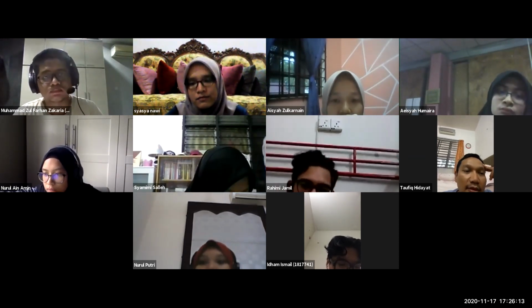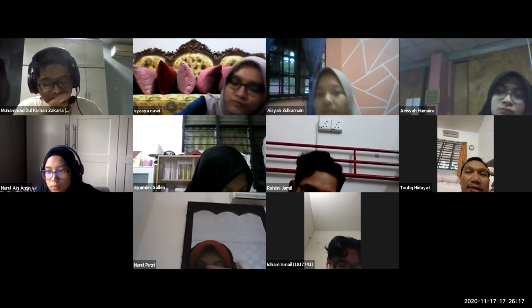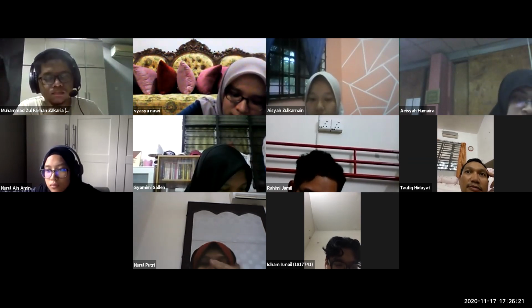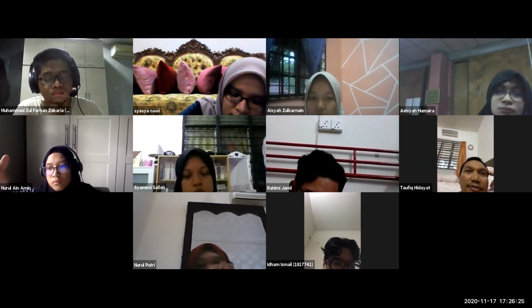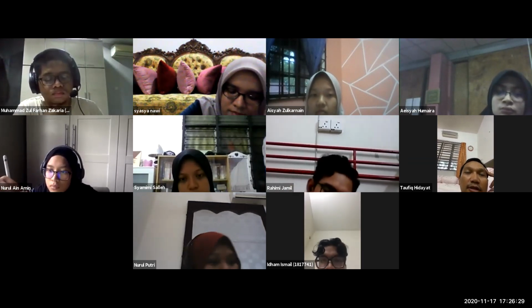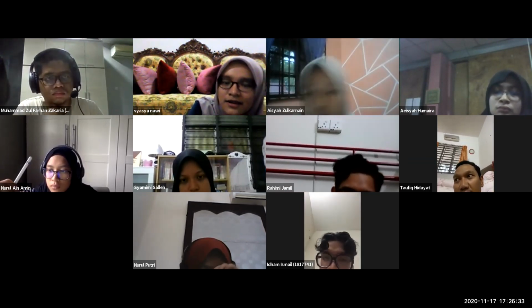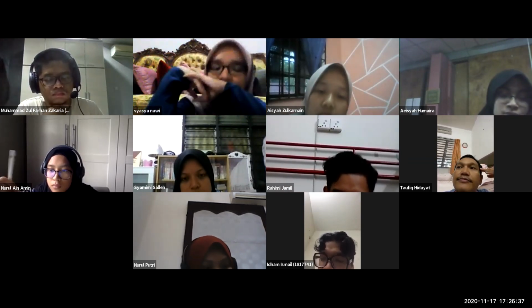So tak boleh cucuk kat situ. Usually memang limited on L2, 3, 4. Usually we can go L2 first, and then kalau fail first attempt we can go downward, and then L4, kalau fail naik atas.